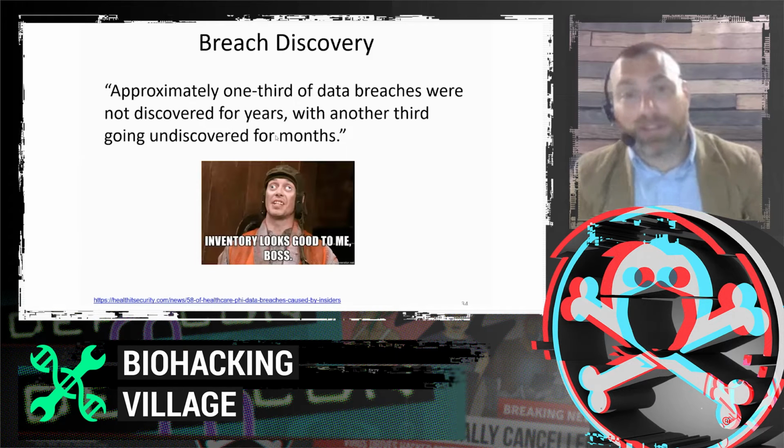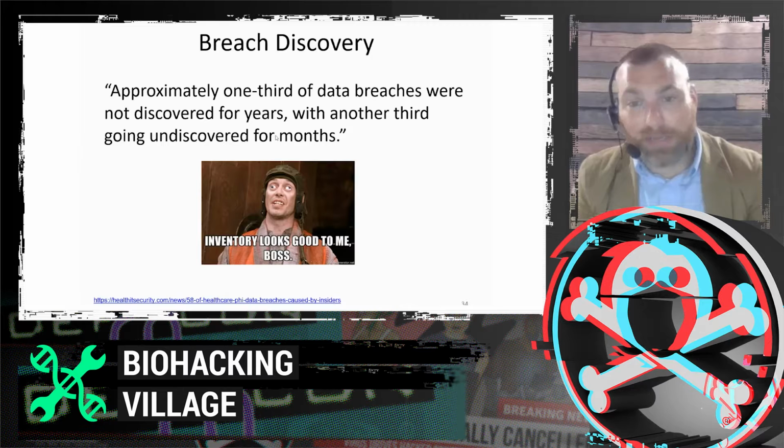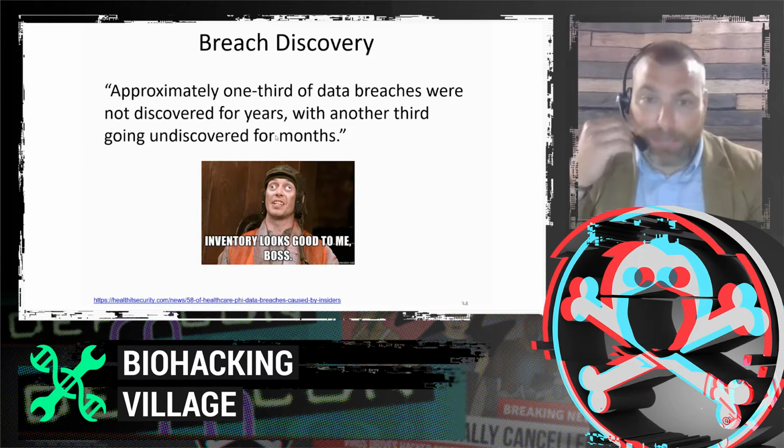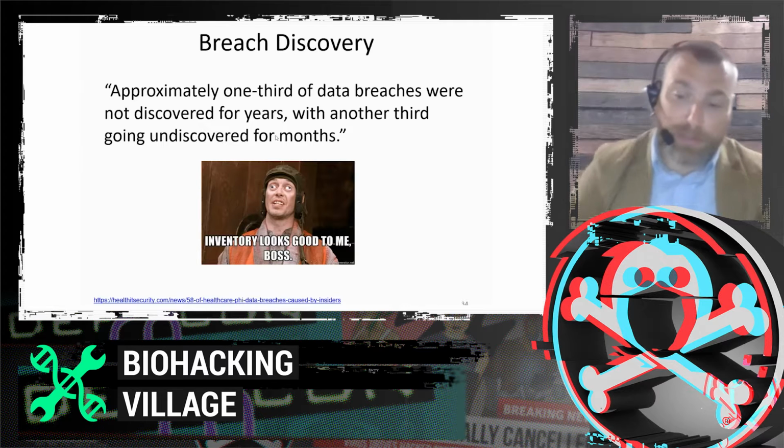Breach discovery is also an issue within healthcare. Approximately 1/3 of the data breaches in the 3-year study were not discovered for years. Another third were not discovered for months. So it's important to note that when you're looking at the numbers or considering if you've been breached, many hospitals may not even be aware of it.